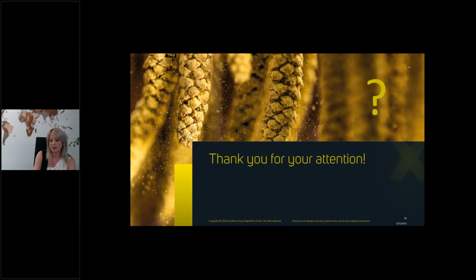Okay, and is serum the only sample type they can use, or can they also test plasma samples? You can also test plasma samples, yes. Not EDTA samples, but citrate and heparin samples can be used as well.